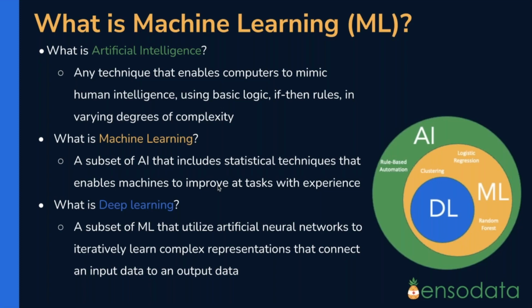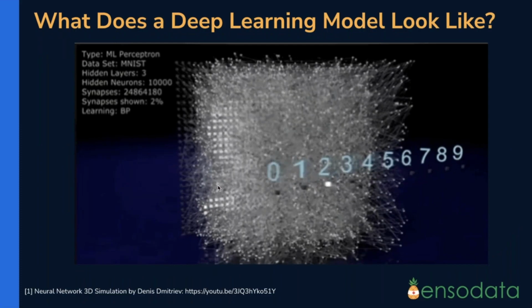So in images, it can be pixel-level information like color, intensity, texture. And in waveform data or signal data, it can be the waveform frequency, the waveform shape or amplitude. So the same way you can train a deep learning model to detect an image of a cat or a dog, you can train it to classify a sleep waveform as well.